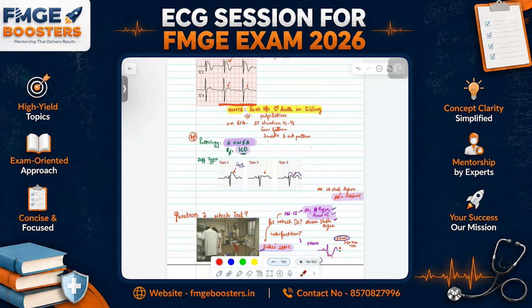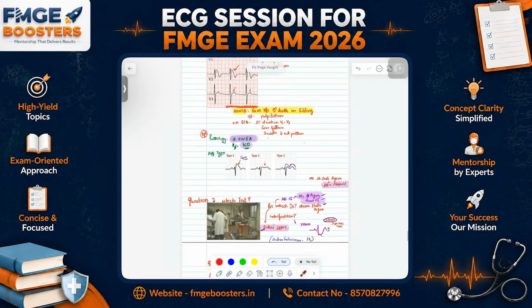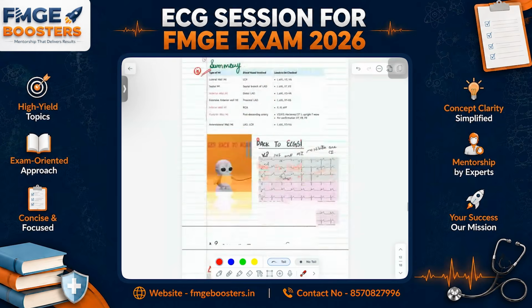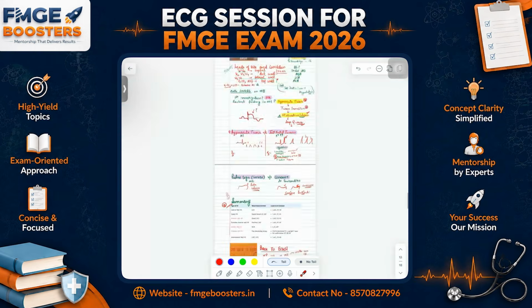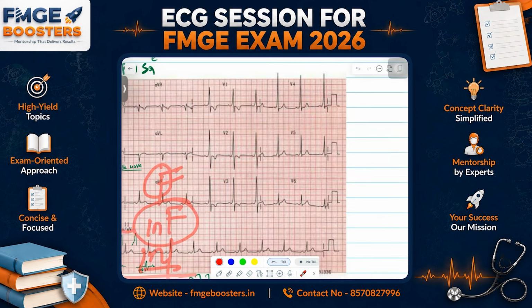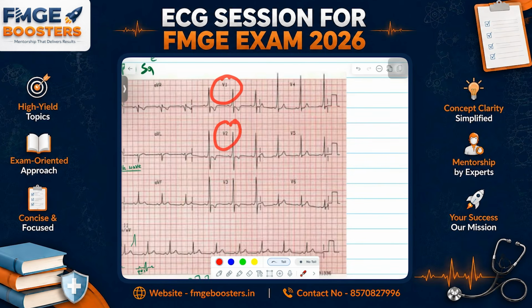ओके ओके। एक और चीज आप बता दो मेरे को, जो ये MI वाला था। यार, वो मैंने आपको समझाया था कि अगर हम बात कर रहे हैं, तो पहले इंफीरियर वाला सबसे अलग है, इंफीरियर वाला याद कर लो। It is just 2, 3 and aVF. I told you aVF means inferior, plus 2 and 3 will be inferior wall. ठीक है। Now if we talk about V1, V2 will be septum.